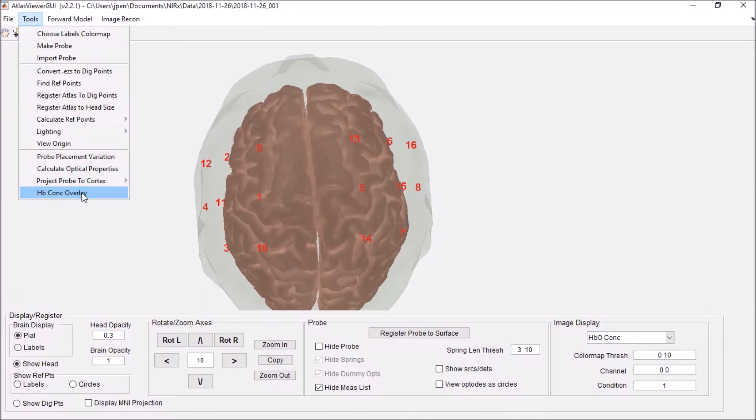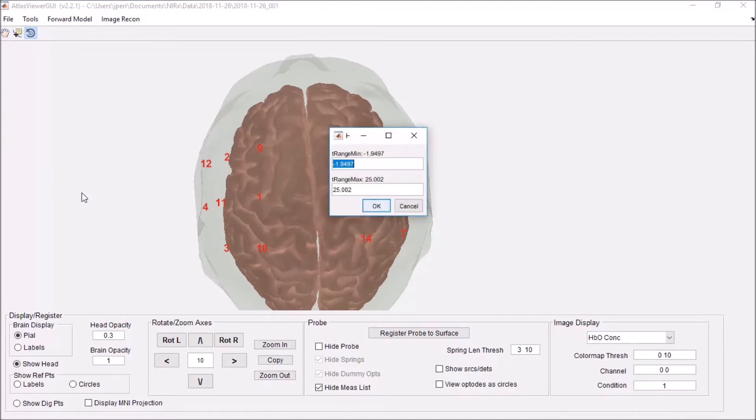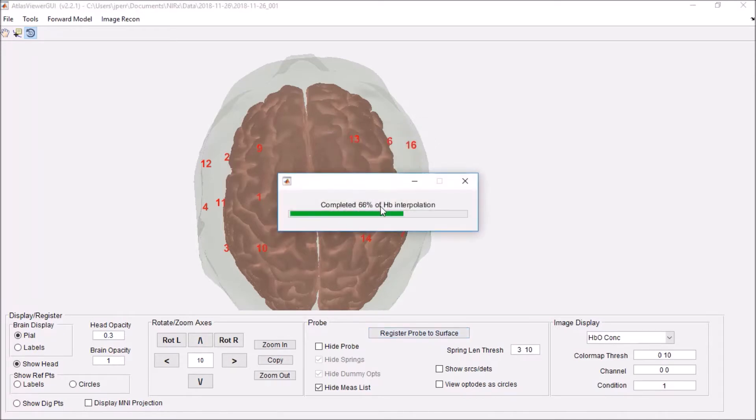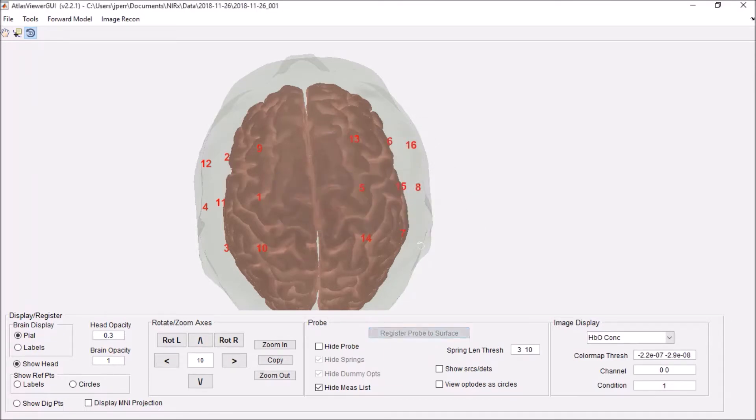you can click HB concentration overlay. It will ask you to select the points that you wish to measure. I'm going to do 24 seconds to ensure that I don't go over my 25 second max. And here we go.